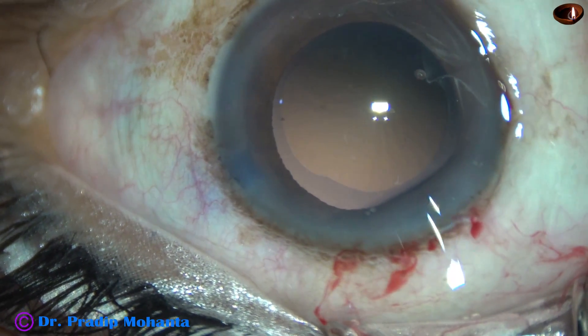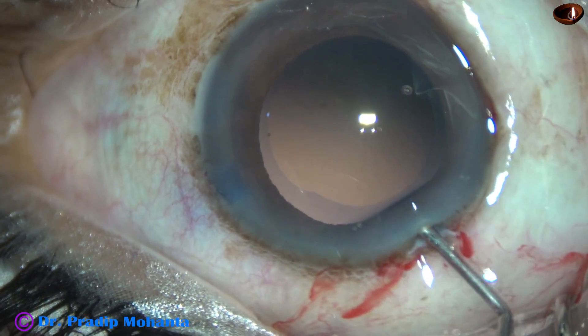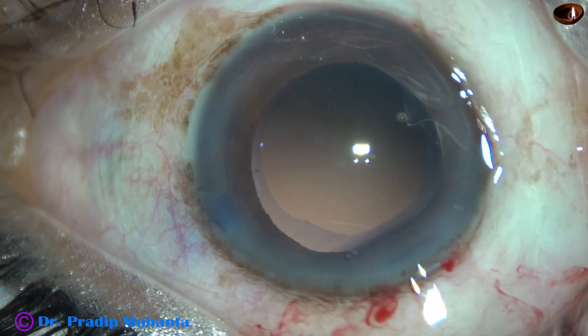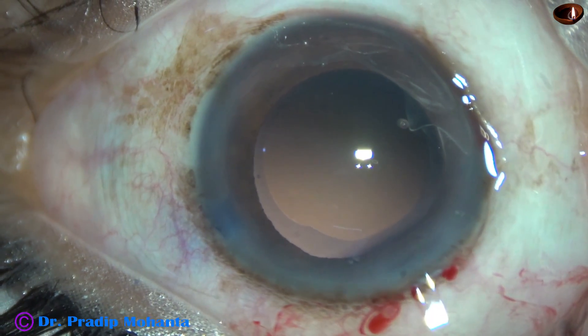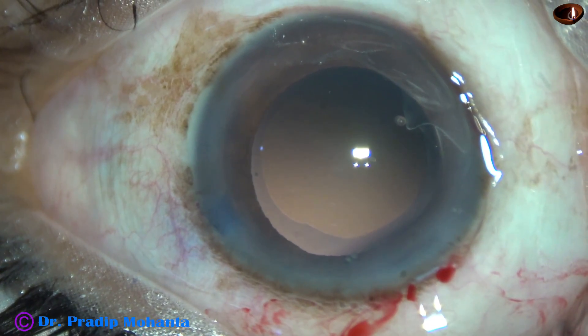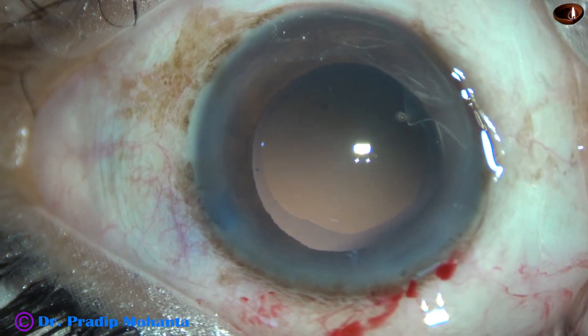Some visco has come out, so the anterior chamber is refilled with viscoelastic. And now, in this case, we are going to implant a Sensar multi-piece intraocular lens.